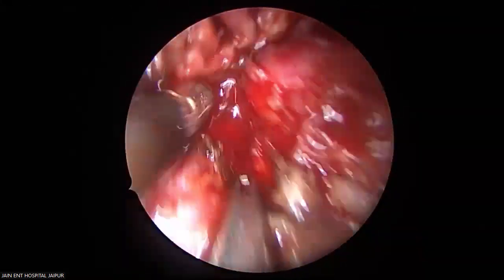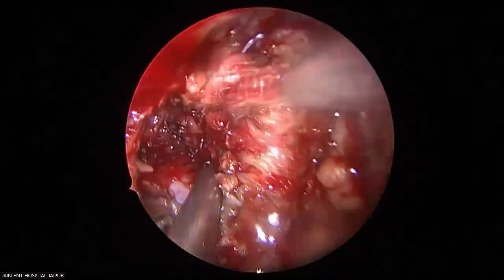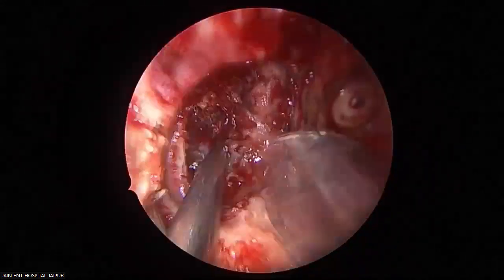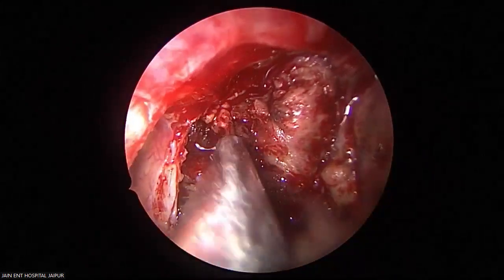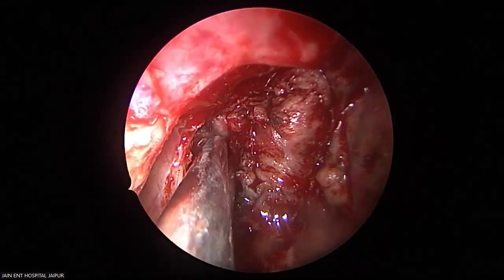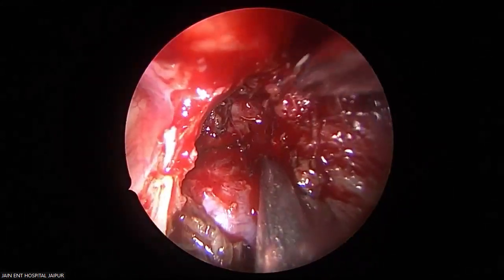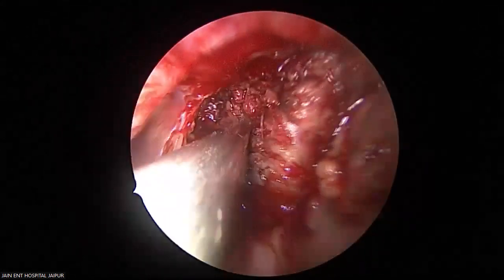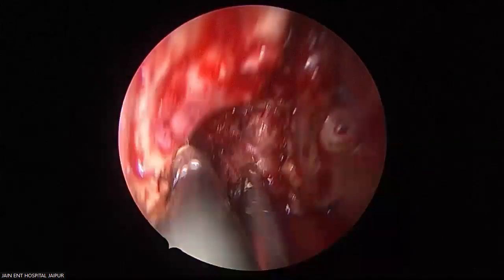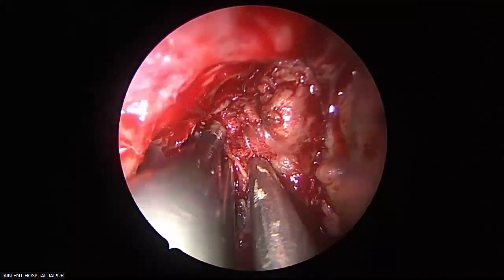I'm looking for any major tumor vessel, if I come across one, divide it. See the exposure of the infratemporal fossa. Improve this, remove this fat and some soft tissues coming in the way to improve your further exposure.